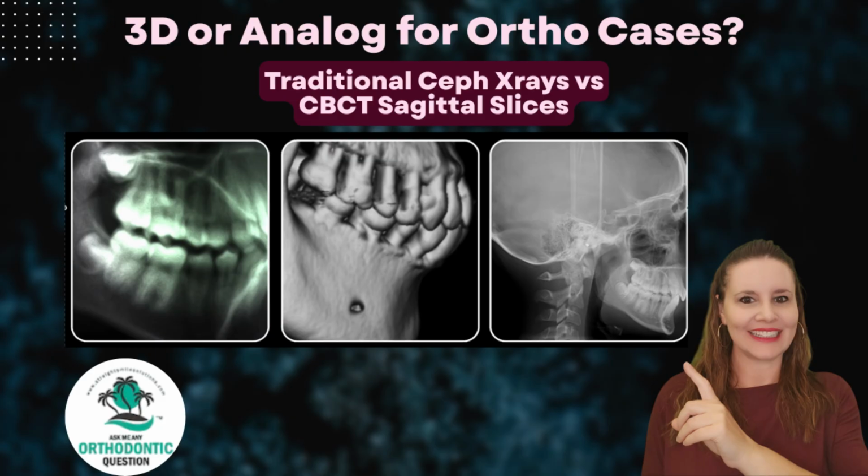Do we look at them on every case? Nope. It might not even get looked at at all, or it's just a quick glance to make sure there's nothing extra crazy. It's just easier for our standard operating procedure, considering we're going to need it on a big chunk of cases, to have the team and all the equipment in place, right? Because it doesn't cost anything extra. We're not outsourcing. We just do it on every case, and then the doctor later lets the assistant know, I need it on this one, I don't need it on that one. So yeah, we have it on every case.